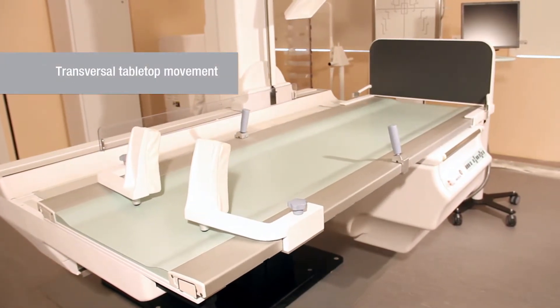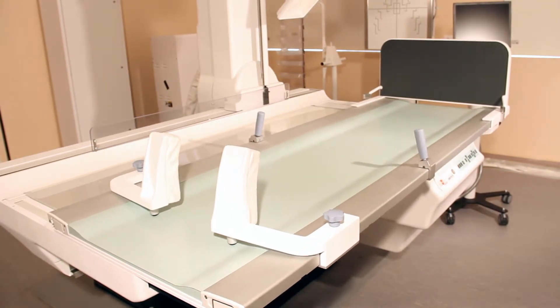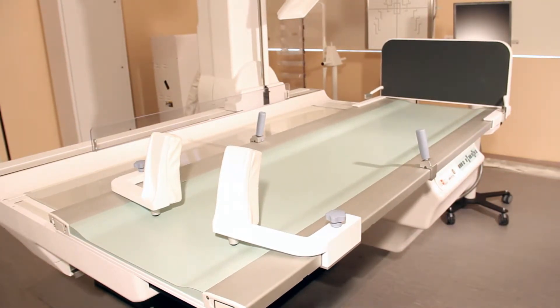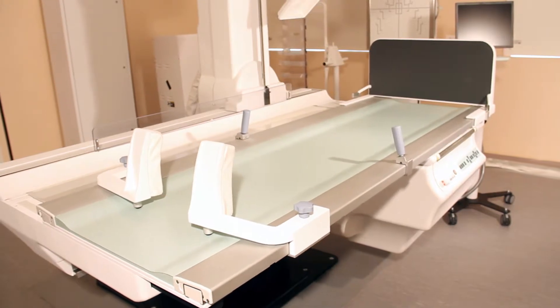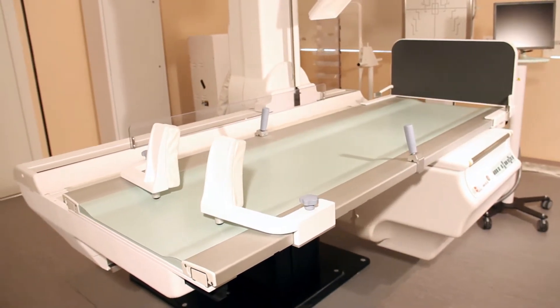Wide transversal tabletop movement gives an opportunity to visualize all the anatomic areas of a patient including peripheral parts.